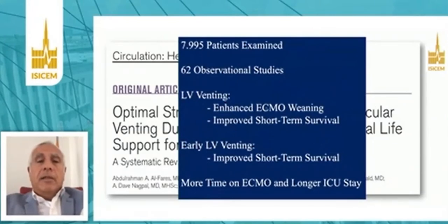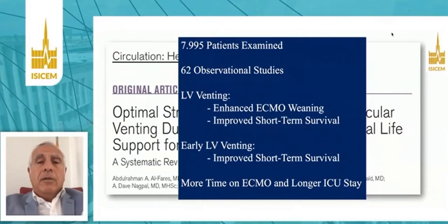Of course, the use of venting increased a little bit the time on ECMO and the ICU length of stay, but still the nice results about the early survival, the early outcome, are really clear. So venting is going to be, I believe, more and more used in this respect.